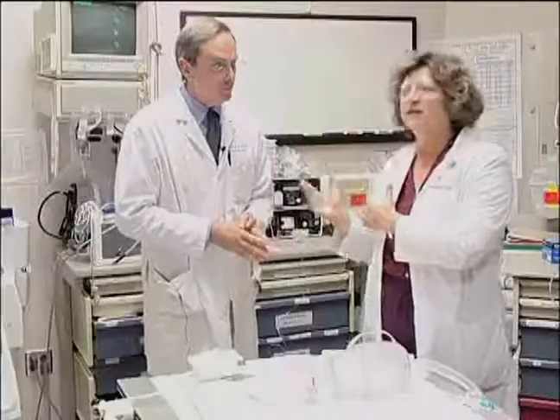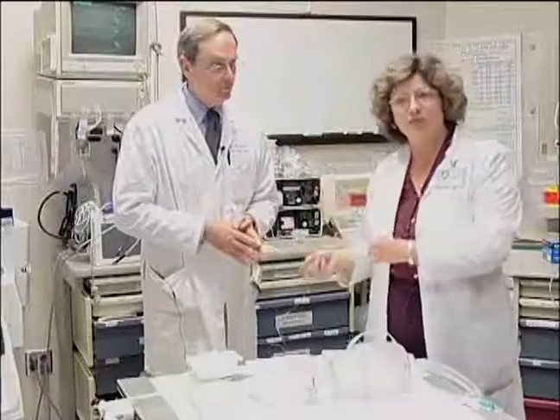Remember that if you bag somebody with really high tidal volumes and pretty fast, sometimes in the patient that doesn't have enough fluid volume, you can compromise their venous return to the right side of the heart and actually have their blood pressure go down. So if you're standing here and you're bagging and you hear the nurse tell Doc 1 that there's now a new low blood pressure since you started bagging, just be aware of that and kind of make eye contact with Doc 1.